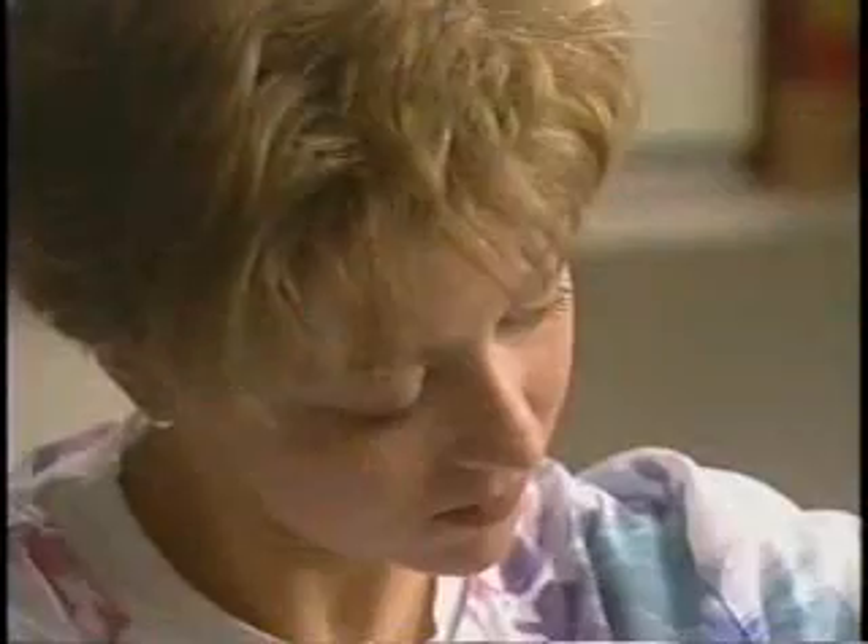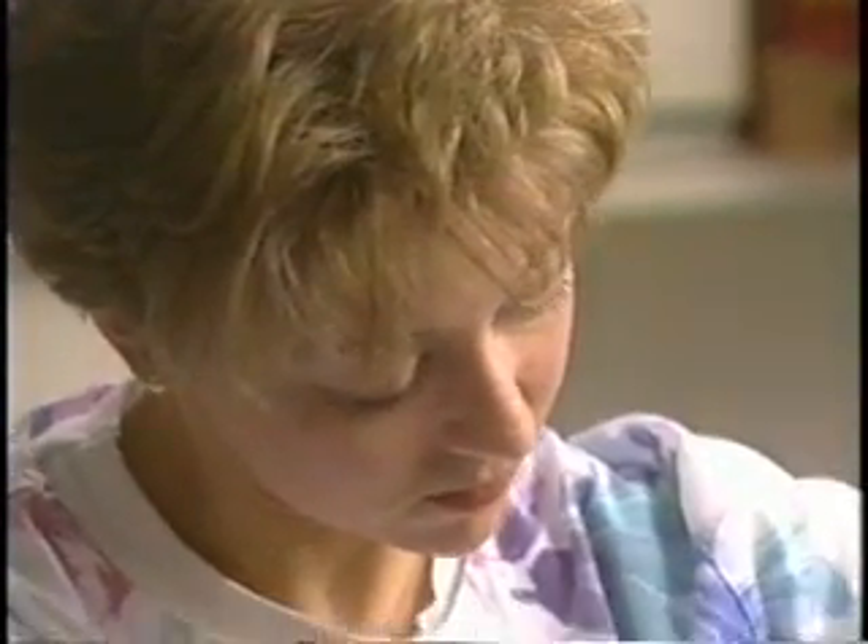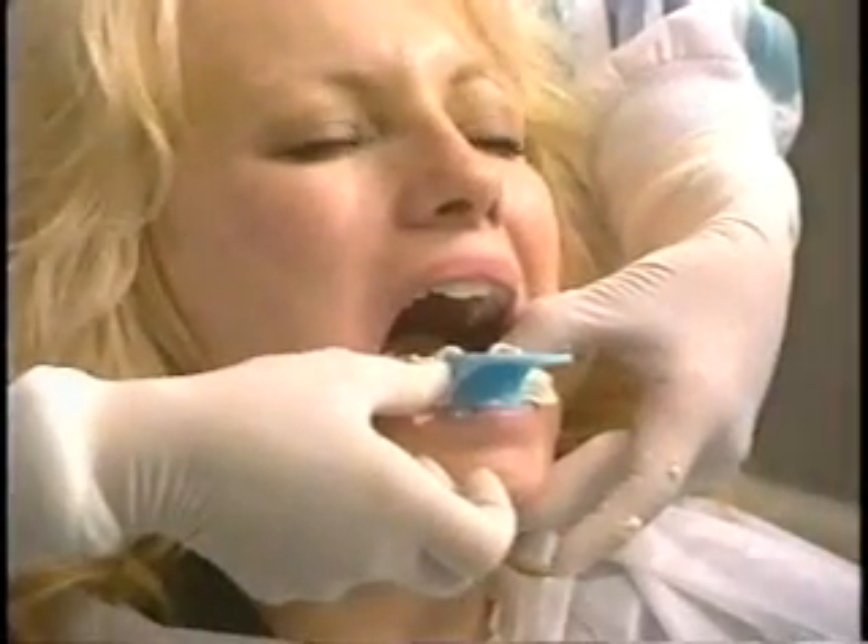The ease of use of the glassband tape in comparison to alternative products out there is far superior. We're able to manipulate this material in such a way that we can keep it very thin within the wings of this bridge and still gain strength. The indirect glassband bridge, fabricated from simple alginate impressions, allows for faster and easier replacement of missing teeth with no unsightly metal.